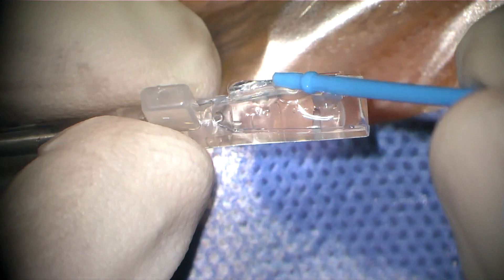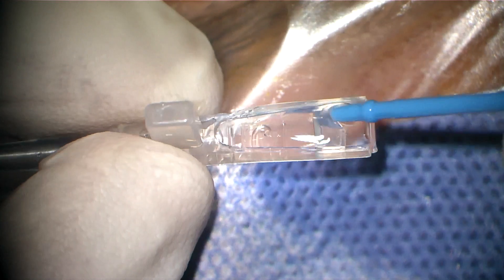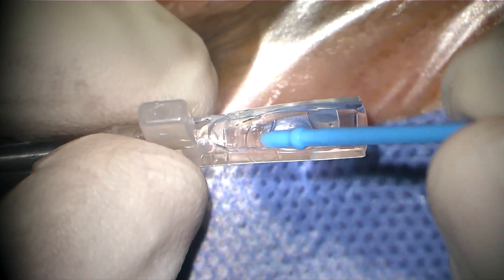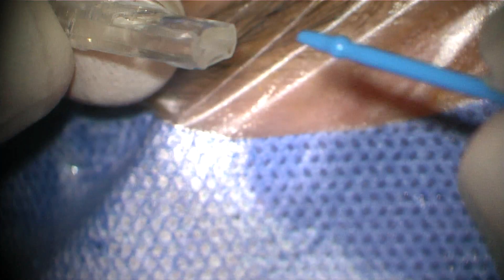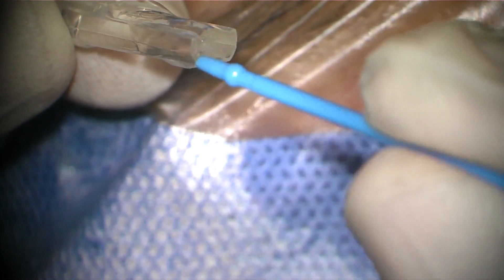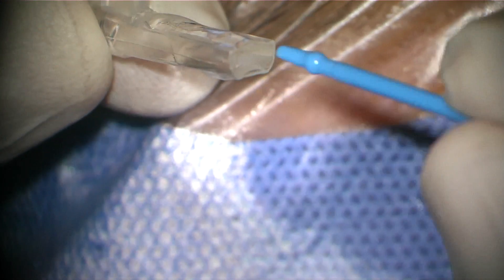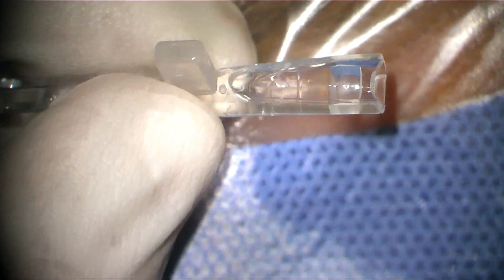Using the plastic end gives better control. As you can see, I have folded the lens with the three dots in one line facing upwards. The lens is now in the correct position — convex part up, concave down — and the haptics are folded on either side.